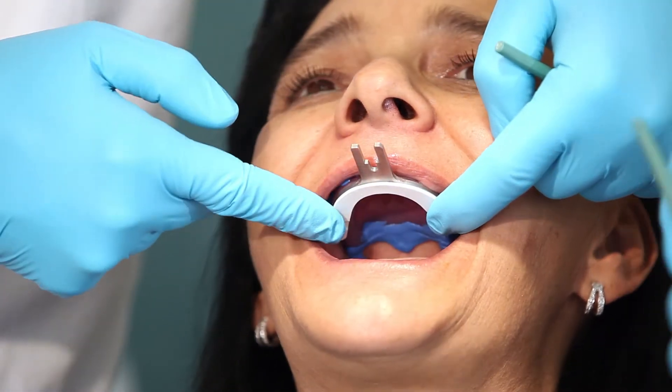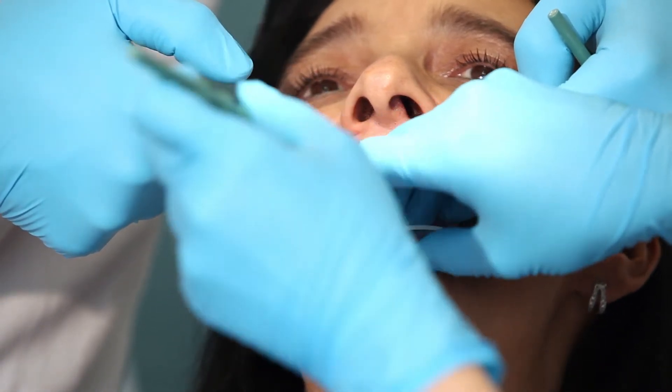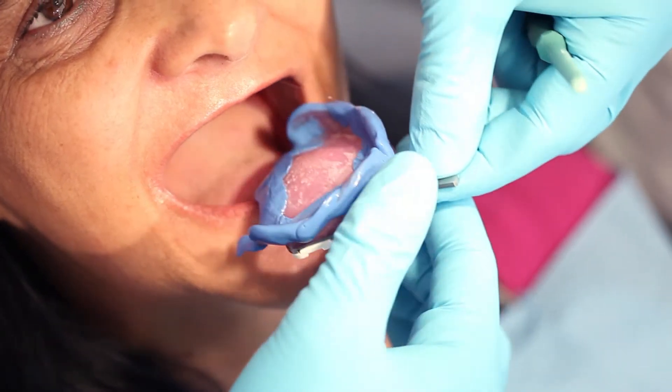Next, insert the tray in the lower jaw. Ask the patient to close her mouth. While the patient lightly bites on the bite plates, she is asked to make certain functional movements. She alternates between pursing the lips and smiling. These movements should be repeated eight to ten times.